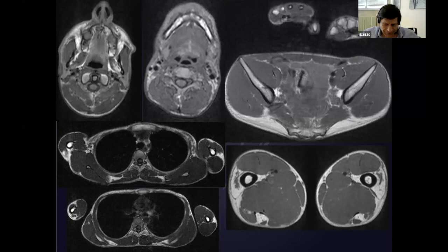Pierre Carlier is more confident with this subject, but in my opinion, now we have the tools, and we have the magnet systems able to perform Dixon techniques, so we can perform fat percentage quantification in select muscles, because all diseases do not have the same distribution in muscle, and some muscles are more important in follow-up in some diseases than in other diseases.